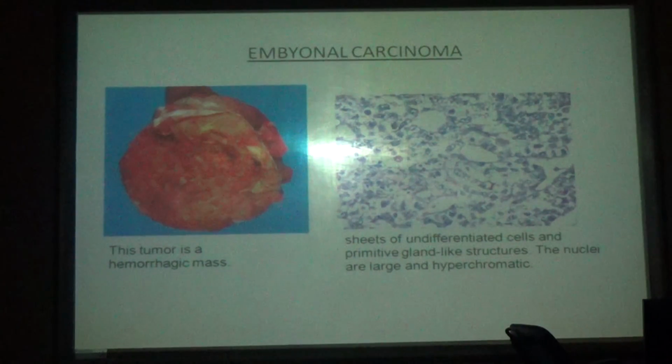All the cells make you feel like they are going to mature, but all the cells are large and hyperchromatic. This is the large and hyperchromatic. If you see it on your laptop, it will be much clearer than this PowerPoint.